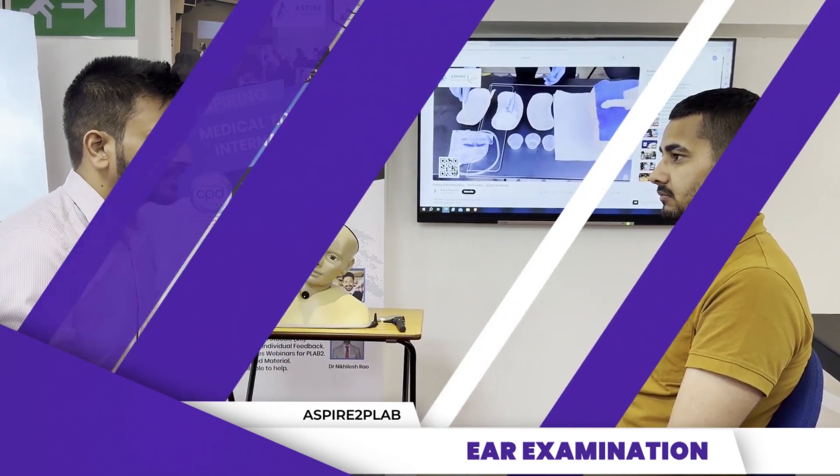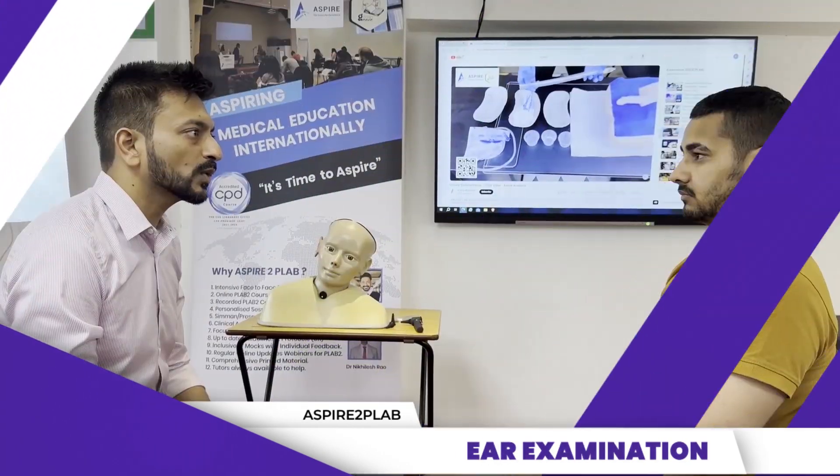John, so now I'm going to examine your ears. For the purpose of examination, I can see you are adequately exposed. Thank you for that. I have a chaperone to ensure your privacy. May I proceed? Yes.